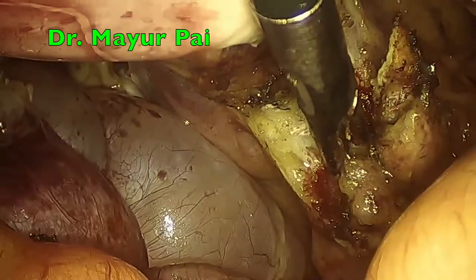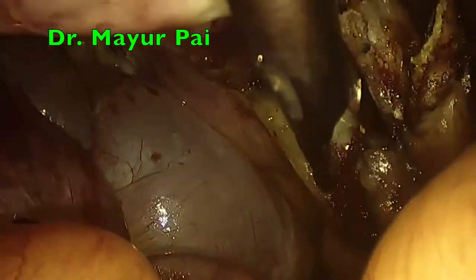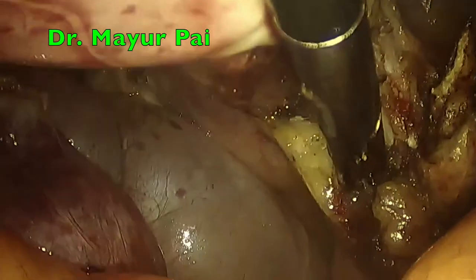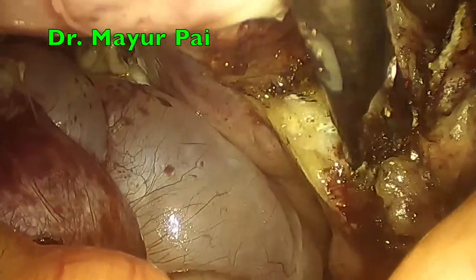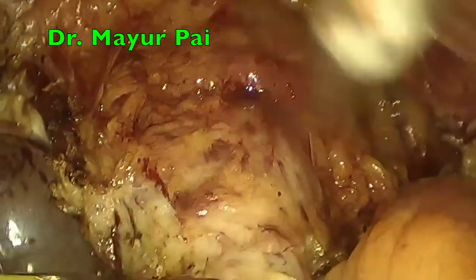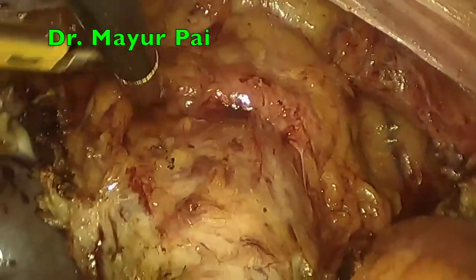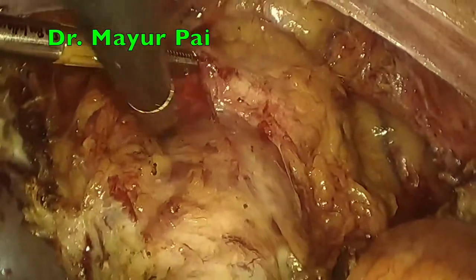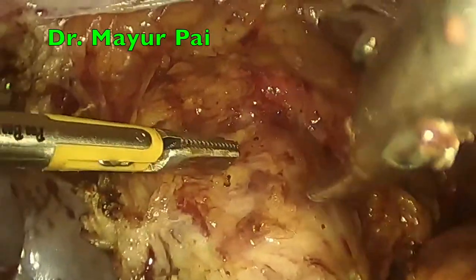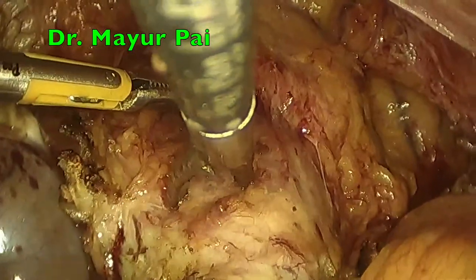One important step that we do in laparoscopic hysterectomy is that we do not remove the attachment of the vaginal vault with the uterosacral ligaments completely. Only the upper portion is cut, whereas the majority of the ligament is still kept attached to the vaginal vault, and this helps in preventing any vault prolapse in the future.